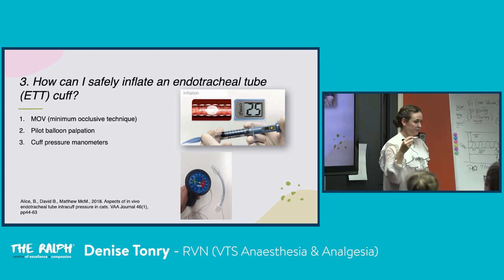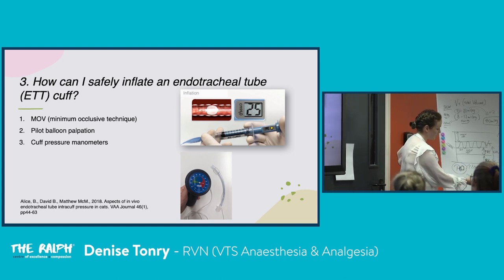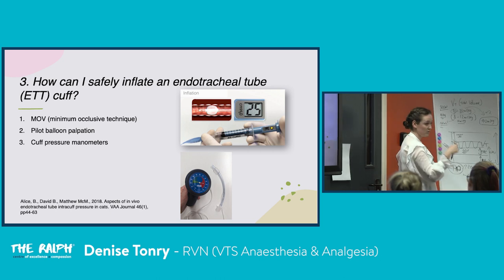And what do we keep hearing? A leak, a leak, a leak, a leak. Keep inflating. What pressures does a patient usually use when they're spontaneously breathing? Around 1 to 2 centimeters of H2O. That's what we're using now.